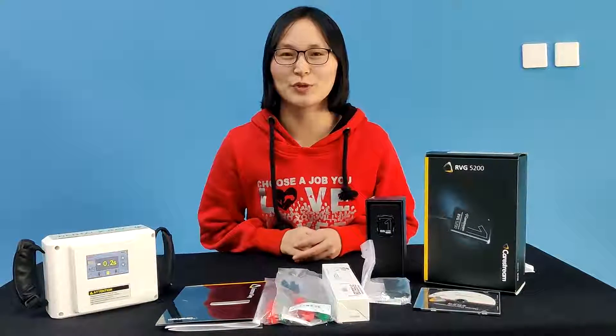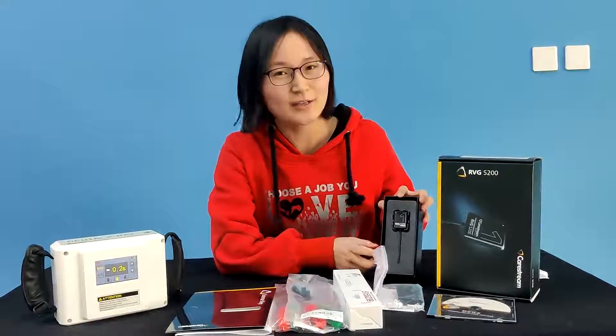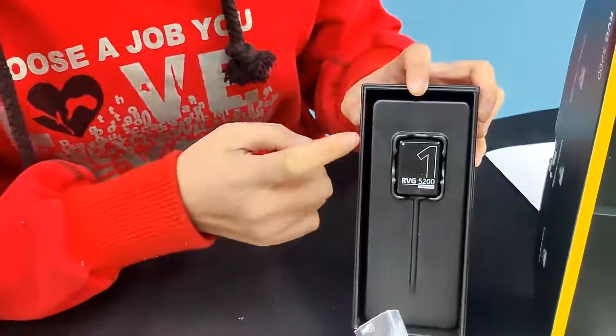Hello, I would like to introduce one of the popular products: the Carestream RVG5200 X-ray sensor, size 1.